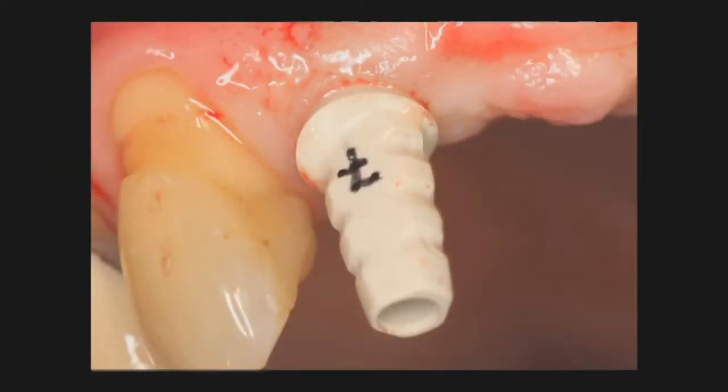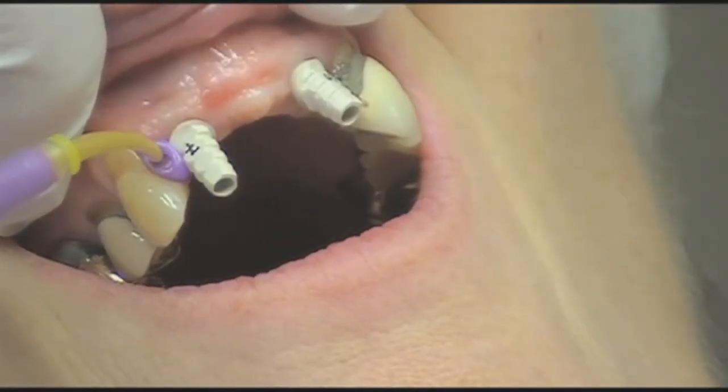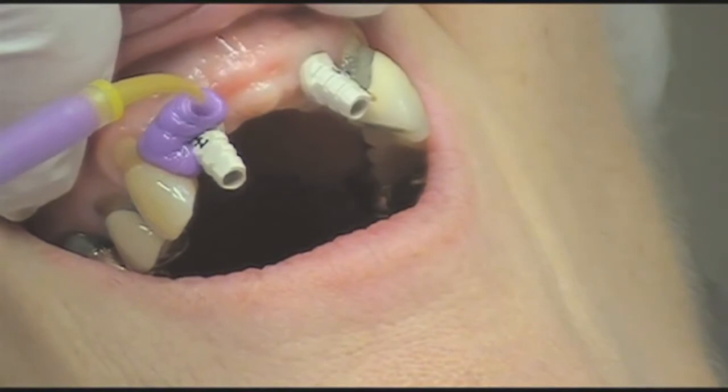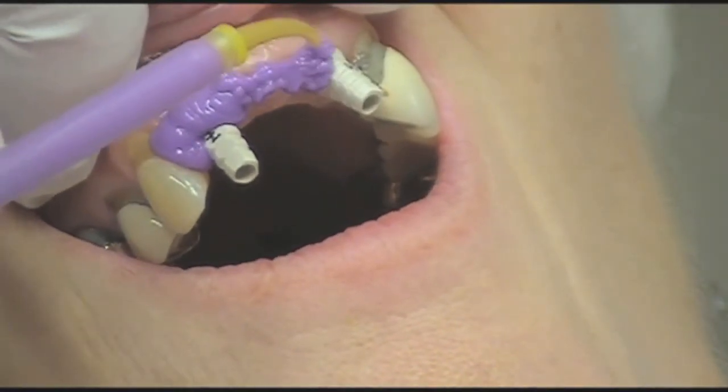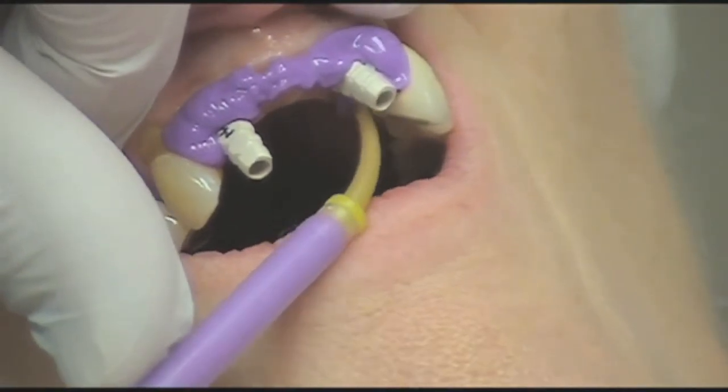This is totally different than what we've done in the past, where we've had stock impression copings. So we may have nice tissue healing, but then we put a straight impression coping in there. The tissue shrinks, and the laboratory at that point has to guesstimate where the soft tissue is going to be. So when we seat our final bridge, we get blanching and potential tissue trauma.